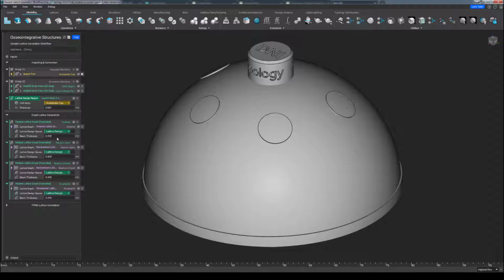If you skim your eyes down to these different variations of lattice structures that I have created, you can see that my desired beam thickness for these lattice structures vary from structure to structure, so I chose not to make that beam thickness input a variable. Again, purely preferential, but I find this to be more organized in my mind.